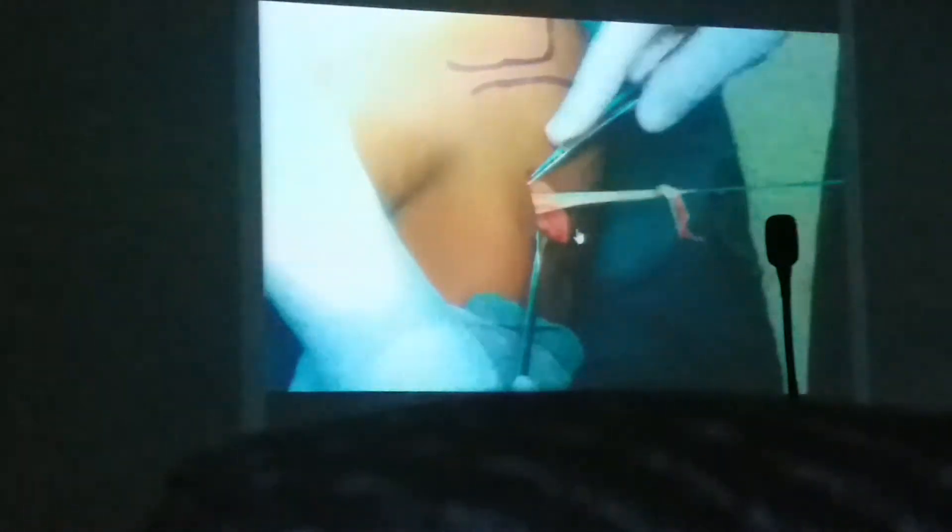Once we have that, we are now searching for the partial attachments. This is one of the partial attachments that we have found and we have to cut it. If the tendon is not free, you are going to have a premature amputation of the tendon. This is the second partial attachment. Usually 2 to 4 is the range, but 2 are the standard ones.